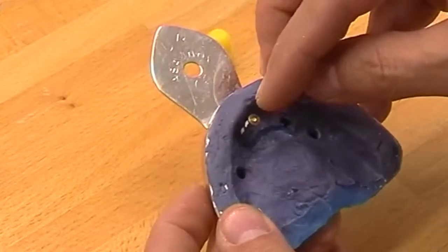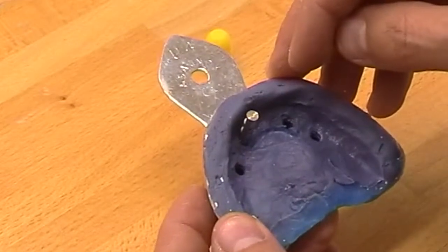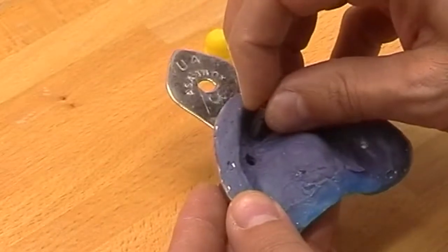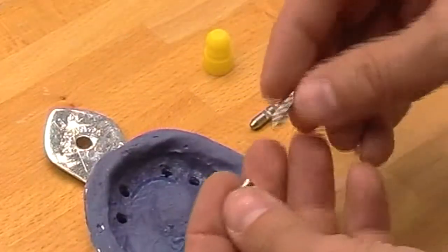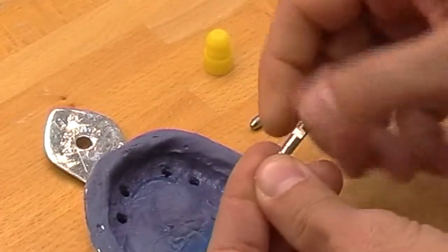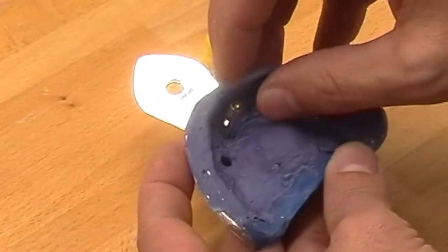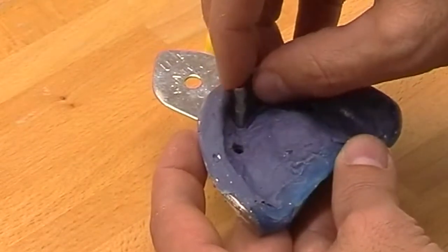Let's try it in another position. As you can see here we do not have enough space between the impression material and the analog, so the cast would be too thin in this area. In such cases it is much better to use an angled abutment analog. We screw an angled abutment analog onto the transfer and try it in the impression. If we need to change the position we can rotate the assembly — analog plus transfer — inside the impression. Please rotate only clockwise to prevent parts from being unscrewed.